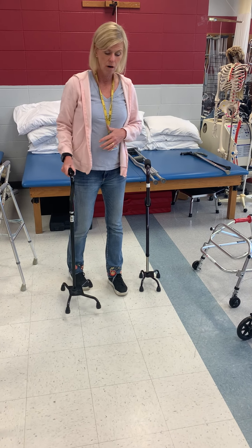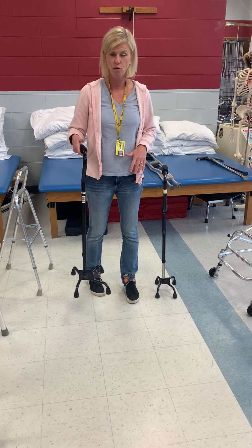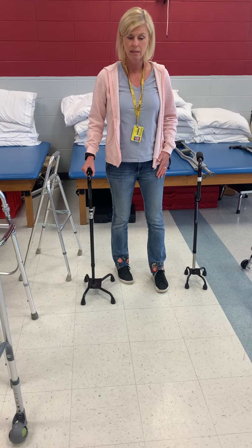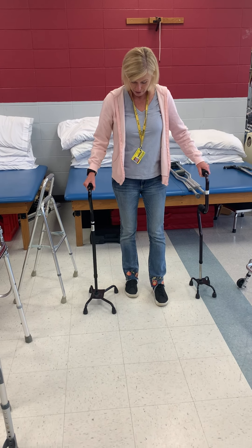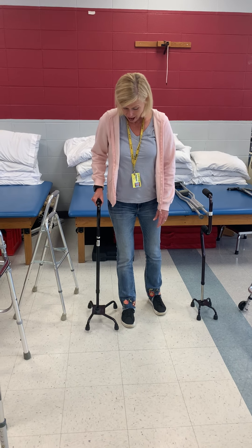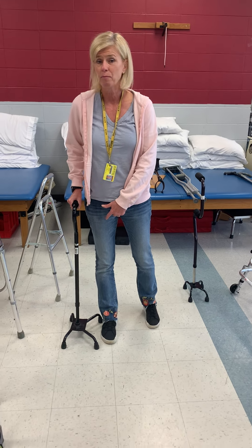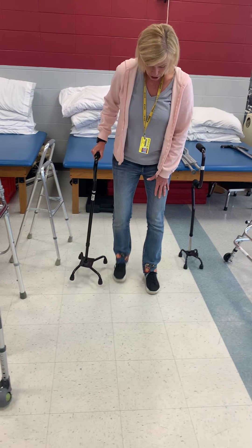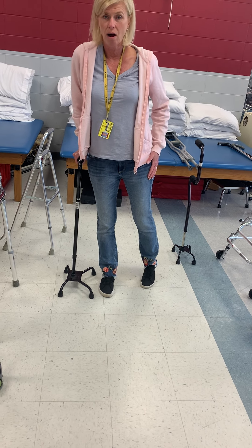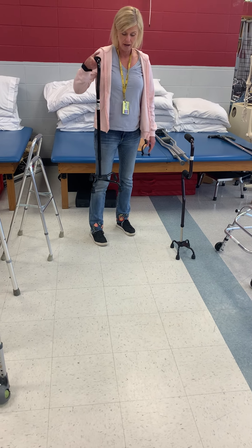Remember — for a cane or one crutch, you always want to use it on the opposite side of the injured leg. That's where it provides the most support. Think about it: you want to widen your base of support. If this is my injured leg and I use the cane on the same side, I'm really not providing any support. So I put all my weight on the cane side, taking weight off the injured leg.